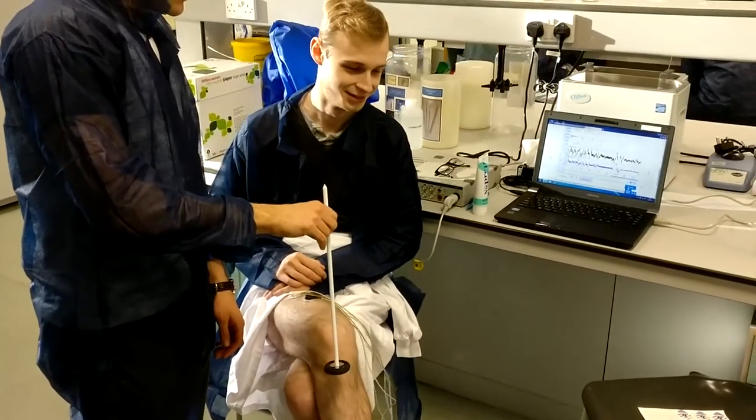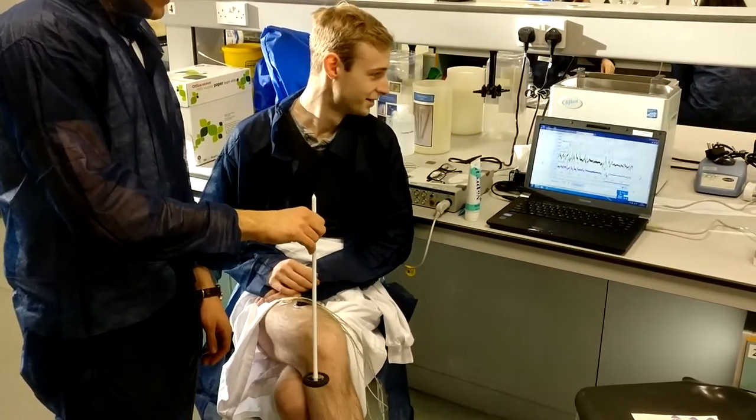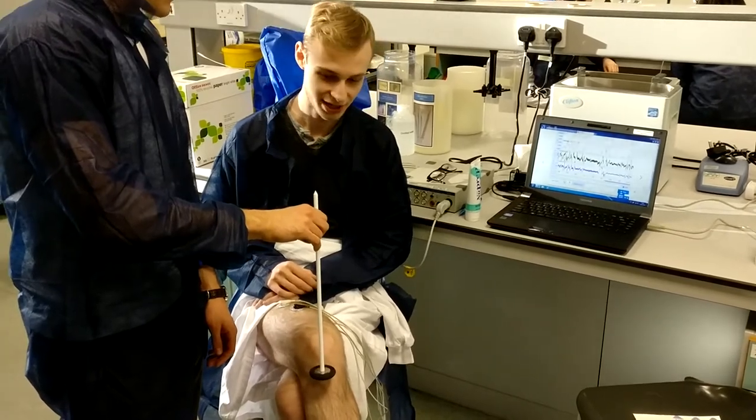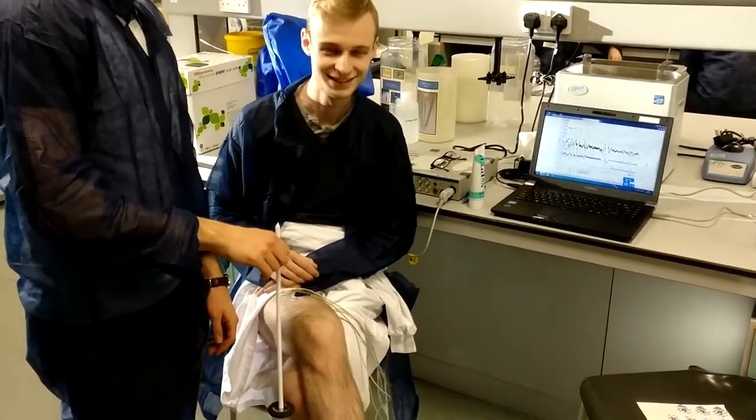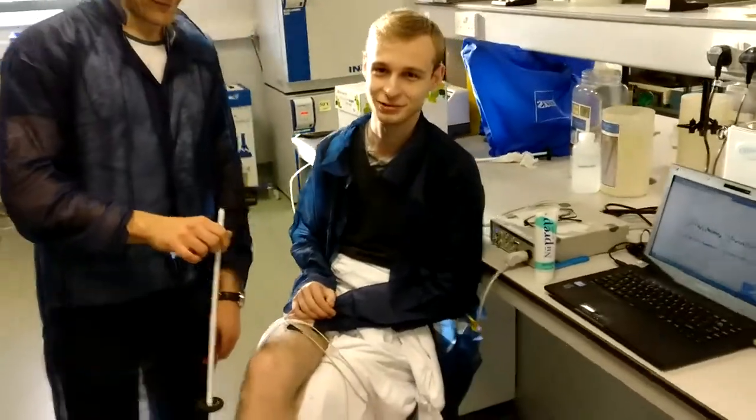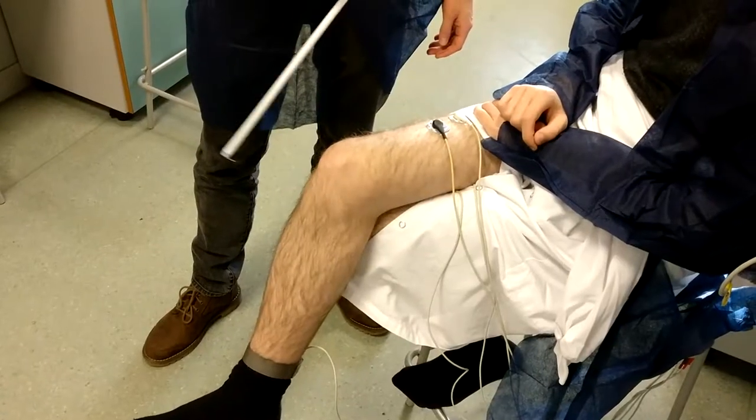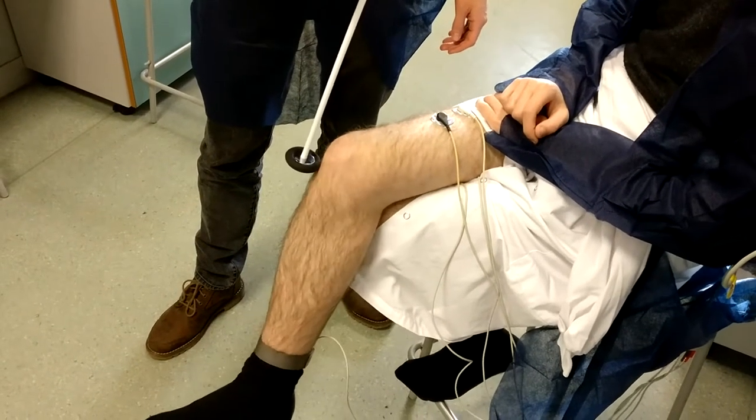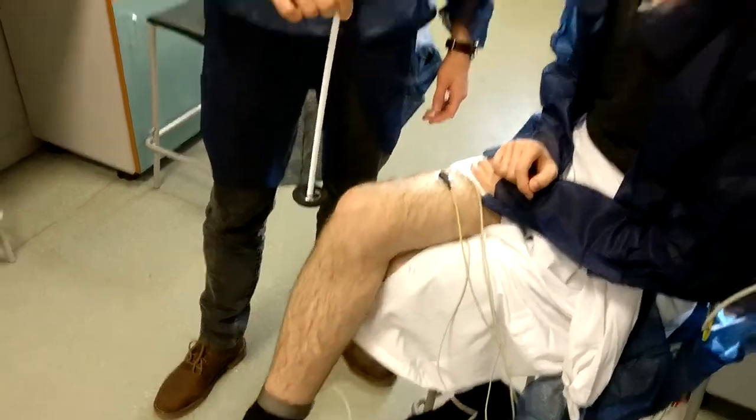There we go. Are you not faking us all? No, no, that is how I... Geez. I have quite a strong patellar reflex. It's your kneecap. Never mind. Don't use that. There we go. Online recording. Perfect.